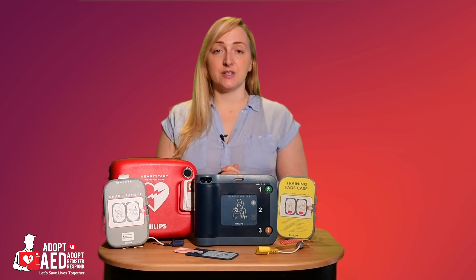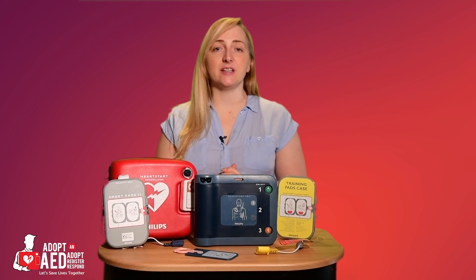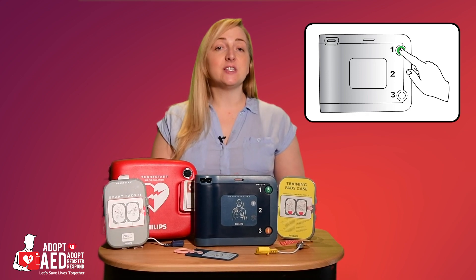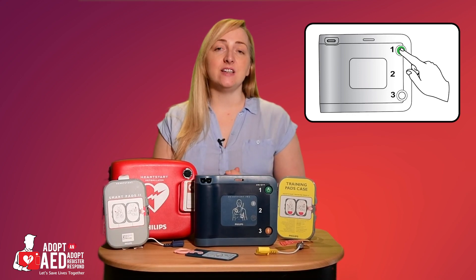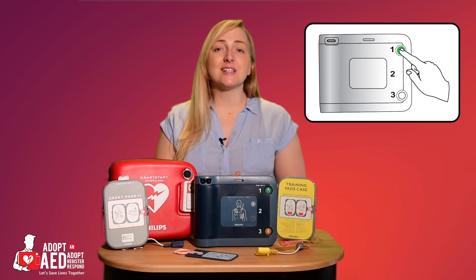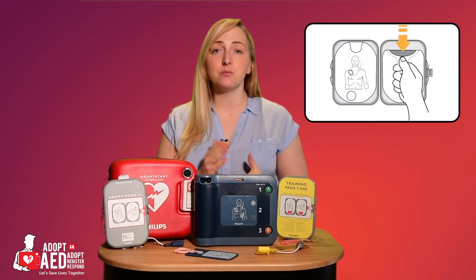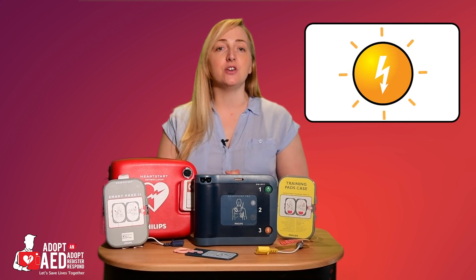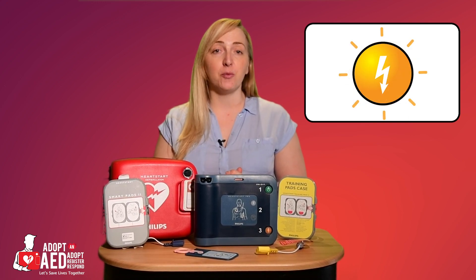The AED arrives virtually ready to use and has everything connected in place. All you need to do is press the green button to initiate the self-test. Once initiated, the AED is ready to use and easy to maintain. The FRX will tell you exactly what you need to do, so when the pads are placed on someone's chest as per the diagrams, the AED determines whether a shock is required and, if so, prompts the user to press the orange shock button.